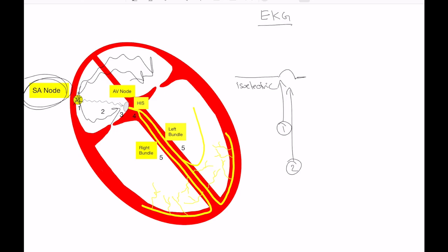Now, once those signals travel through the atrium, they're going to enter this kind of final common pathway or this gatekeeper, if you will, the AV node. That's because the only way a signal can get from the atrium to the ventricle in a normal heart is through the AV node. Now, there are other circumstances that can exist, such as an accessory pathway, like you see in WPW, where actually conduction can go down through the pathway into the ventricle in an abnormal situation. But aside from that, everything's going through the AV node. Now, there's a delay when you get things through the AV node.